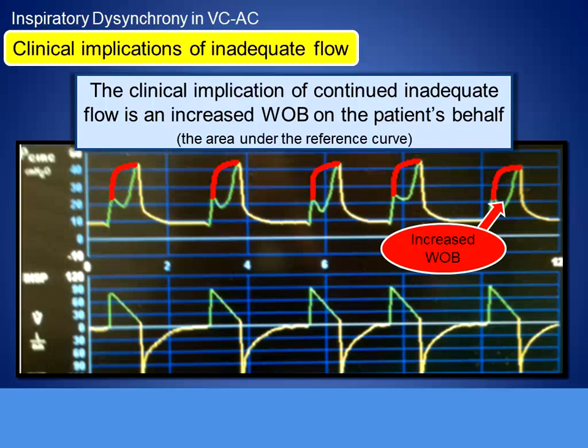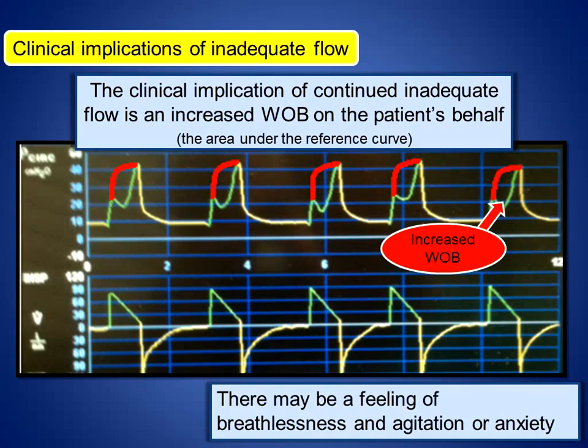The other phenomenon that is accompanied with this is, again, this feeling of breathlessness and agitation and anxiety, because the patient isn't receiving the breath that they're actually demanding, right? And remember what happened when you went to drink your Frosty. You tried to pull it through, and it didn't happen, and your next immediate response was to pull harder. So we're not talking about Frosties and milkshakes. We're actually talking about a breath being delivered to a patient. And it's not being delivered at the flow that they want it. And so therefore, that's why the patient feels the way that they do.